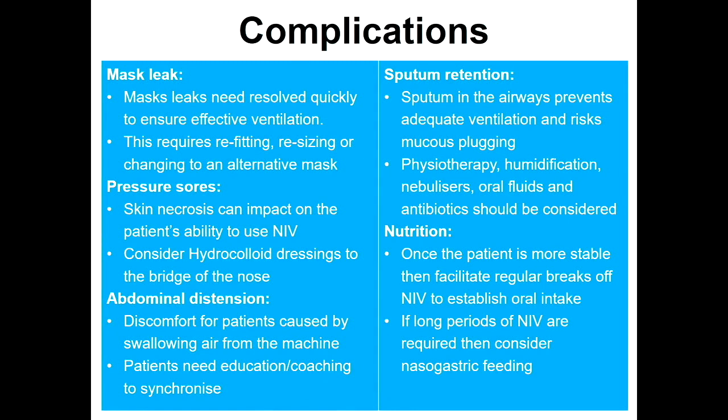This can involve refitting of the mask. So sometimes with the mask, it can become displaced. And to troubleshoot that, you just may need to undo the buckle and refit the mask to see if that helps to correct the seal from the mask leak.